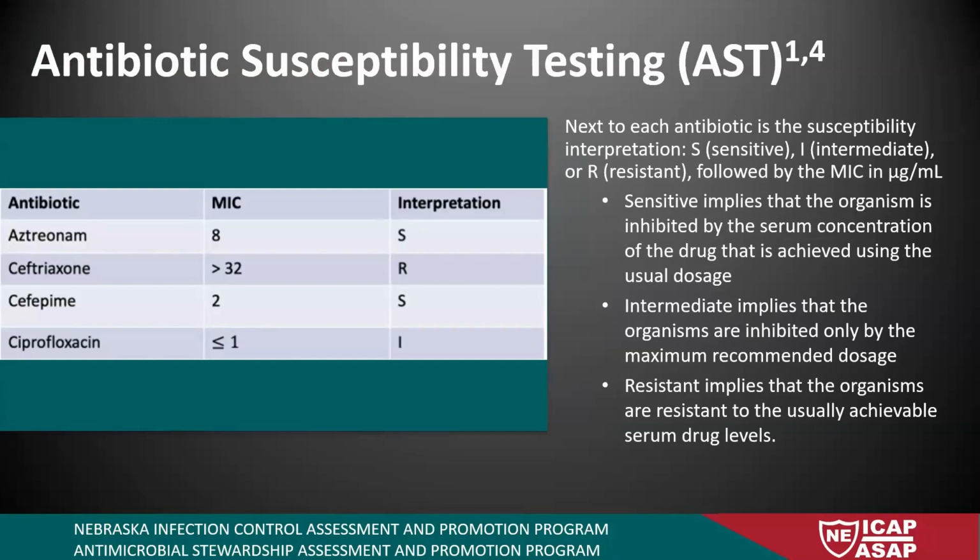And just a few other factors I want you to think about when you're looking at different lab results. One of the things that's always recommended is that you want clear and accurate reporting. And I don't know about you, but I can't read that. That was from a faxed copy of a lab result. I'm sure you see that all the time when you get labs faxed to you. It's not helpful when you can't tell if that's an S or an R. That's a really terrible result. So I would ask the lab or somebody to refax it or send it to you electronically so you actually had an accurate one. That's just something I wanted to point out.